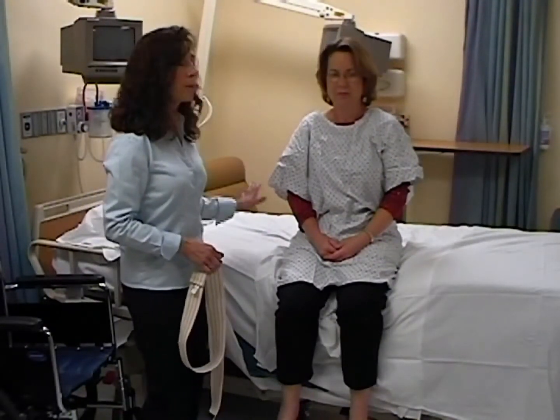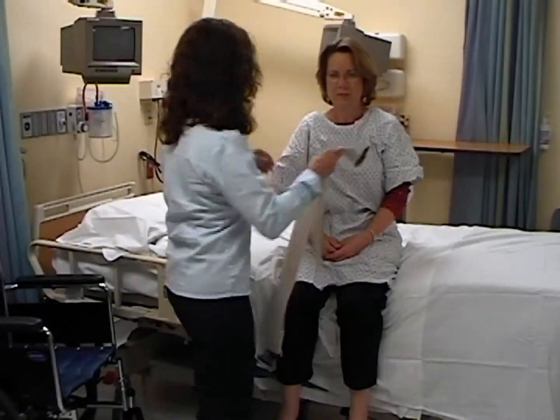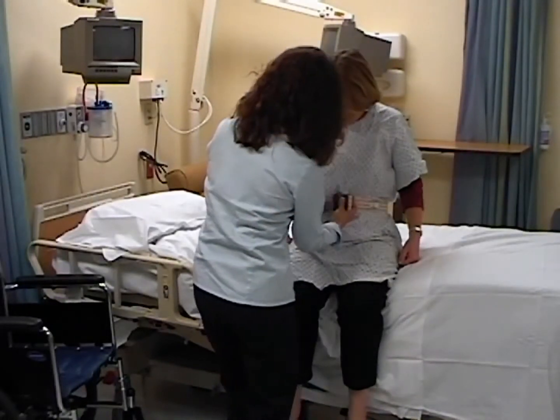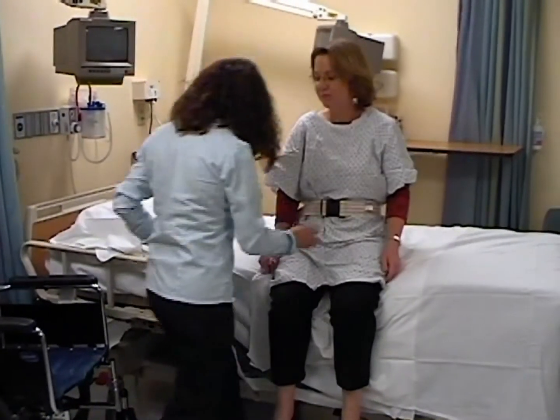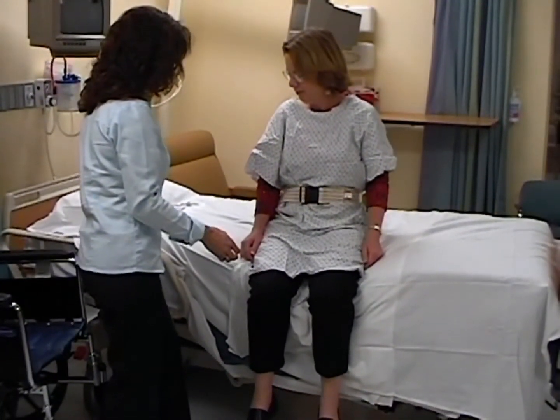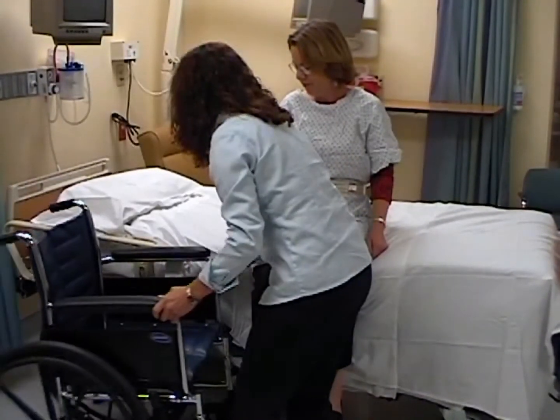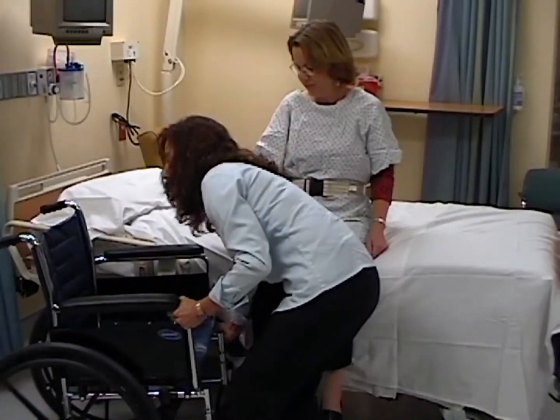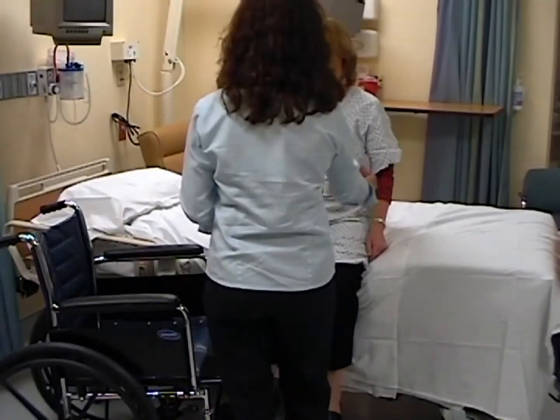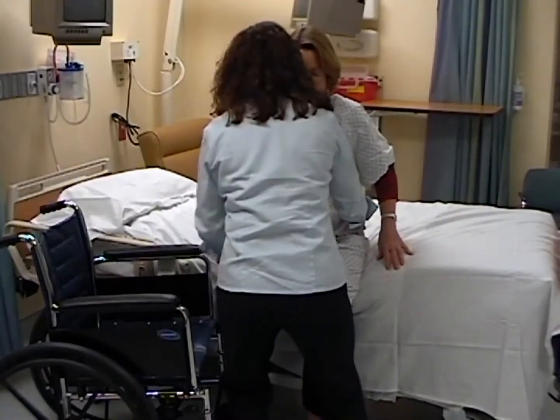Now that we've positioned the patient and they're sitting at the edge of the bed, we want to transfer them from the bed to the chair. We want to use a gait belt for safety. We want to lower the bed as much as we can. Bring the wheelchair as close as you can, usually at an angle, secured by the brakes. Now we want the patient to scoot to the edge of the bed. You can help them by moving them from the buttocks area.